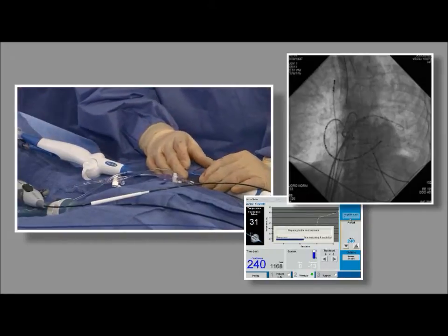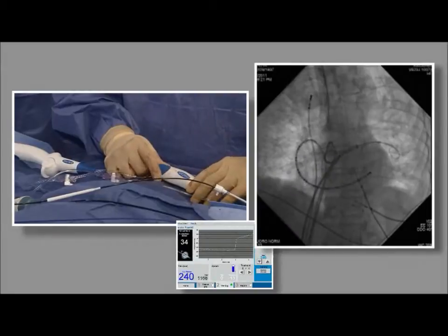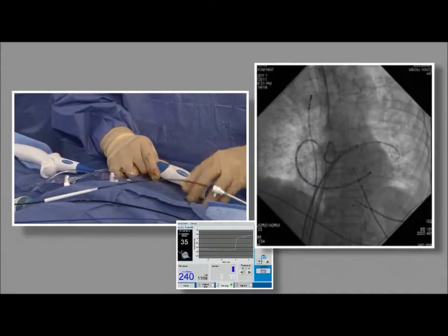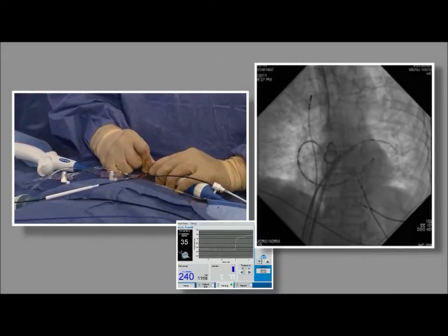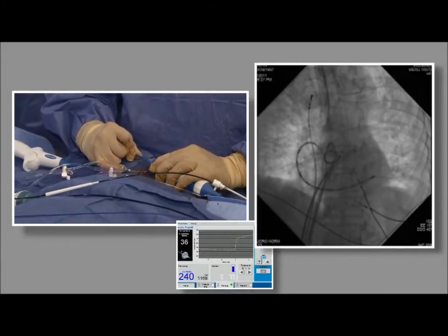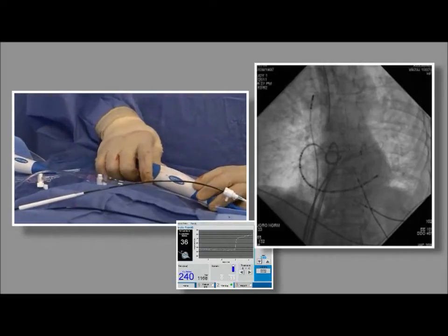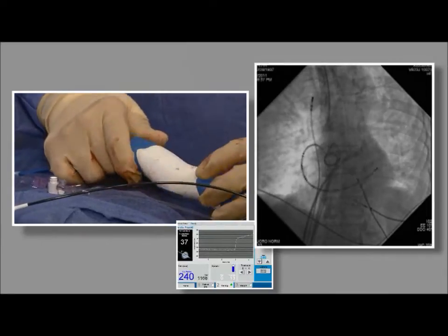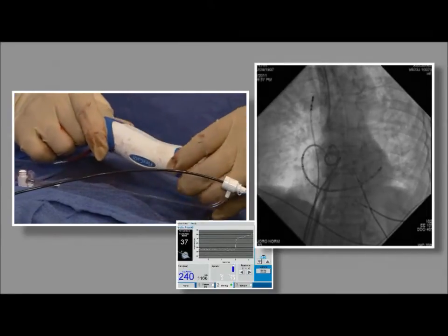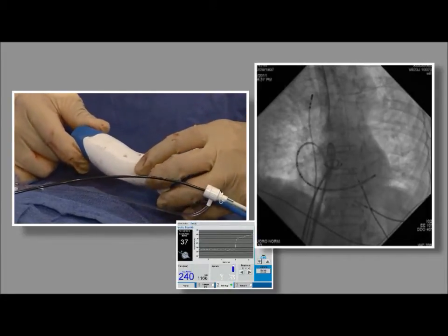When drawing the balloon into the sheath, be careful about how we're doing it. Straighten out the sheath a little bit so we're not trying to pull it back when it's massively bent. It should pull back without too much force — if you have to pull with significant force, just refold the balloon. Going to the right side with a little clockwise torque.